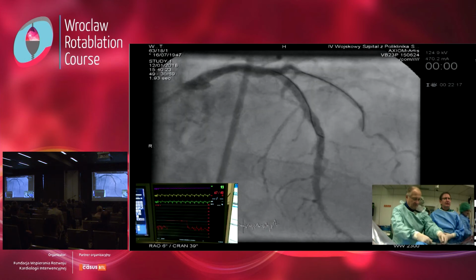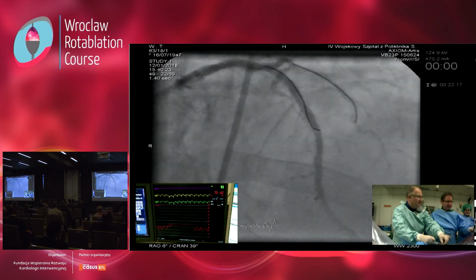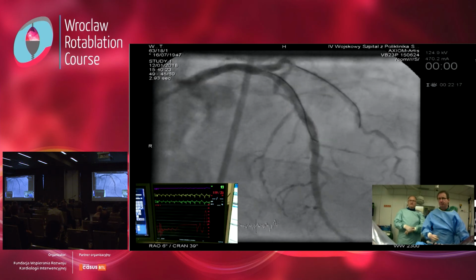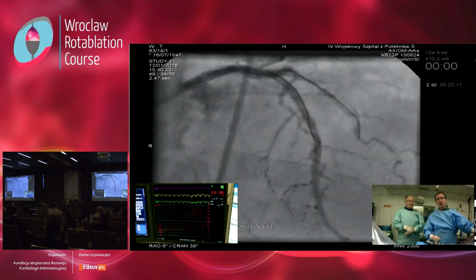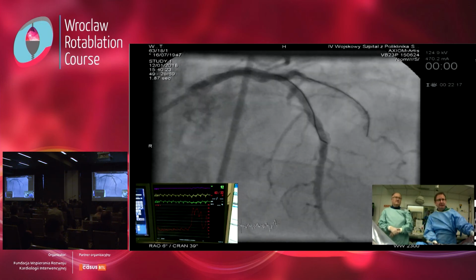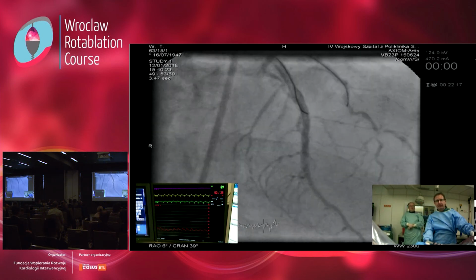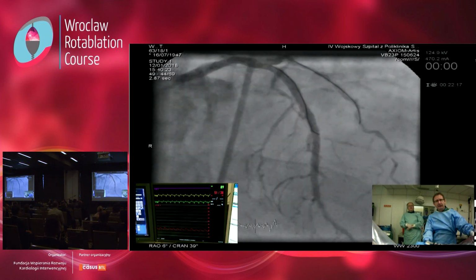And the blood pressure was falling gradually or suddenly? The problem was tachycardia. You know, according to the tachycardia, it was acute problem. Okay, so I think this can sometimes happen even during tough case. The flow is restored, and I believe the patient will recover at ICU.